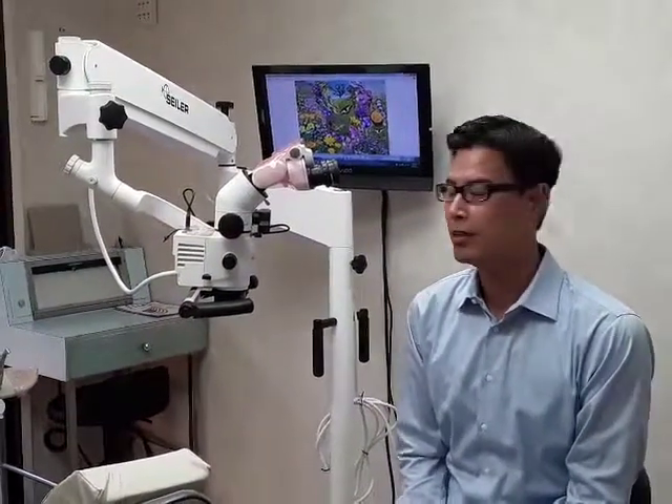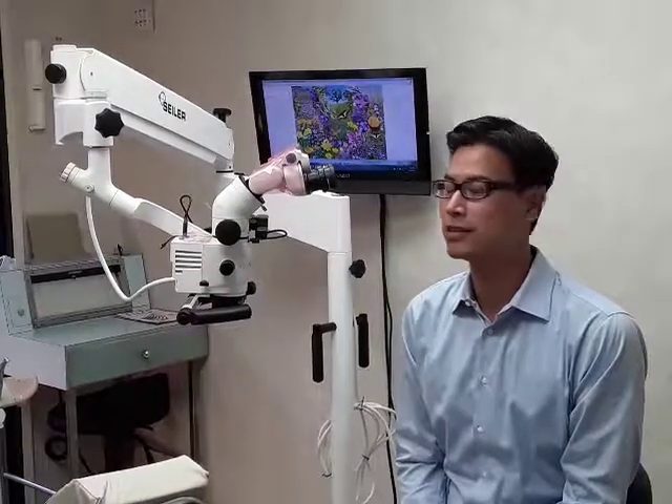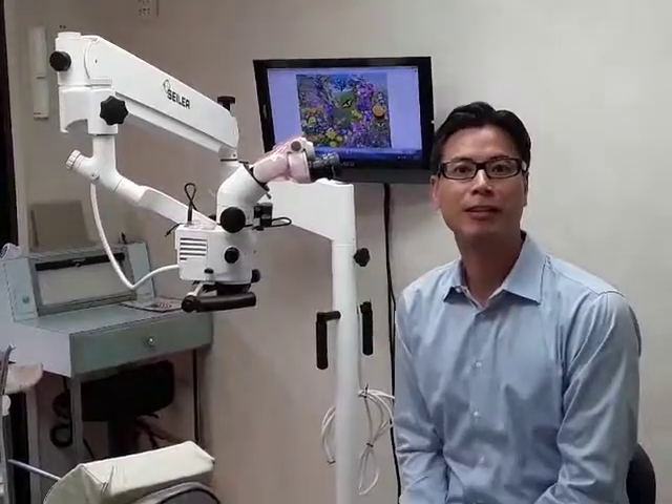What I like best about it: the lens quality gives you a very bright, clear image. I love the vario focus — it gets you into focus very quickly. And for the price, you cannot find a better quality microscope at the price that Cyber is willing to offer. Thank you very much.